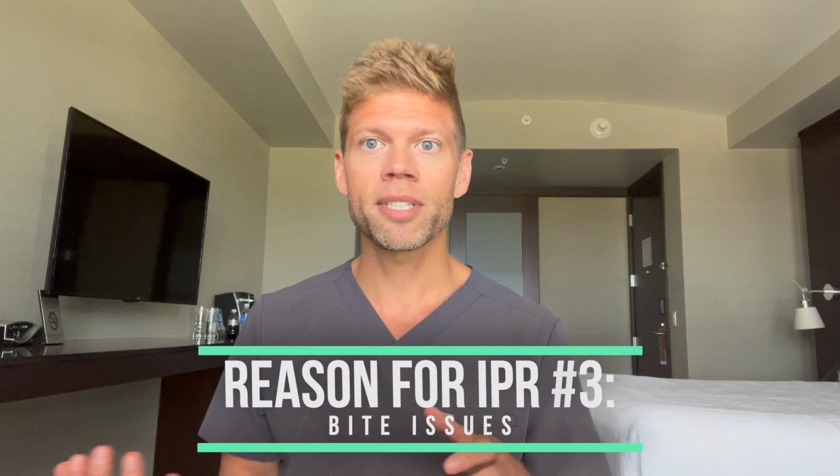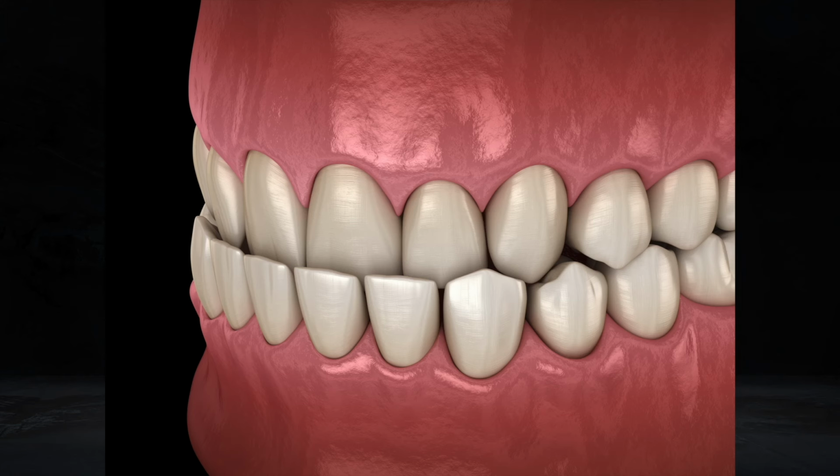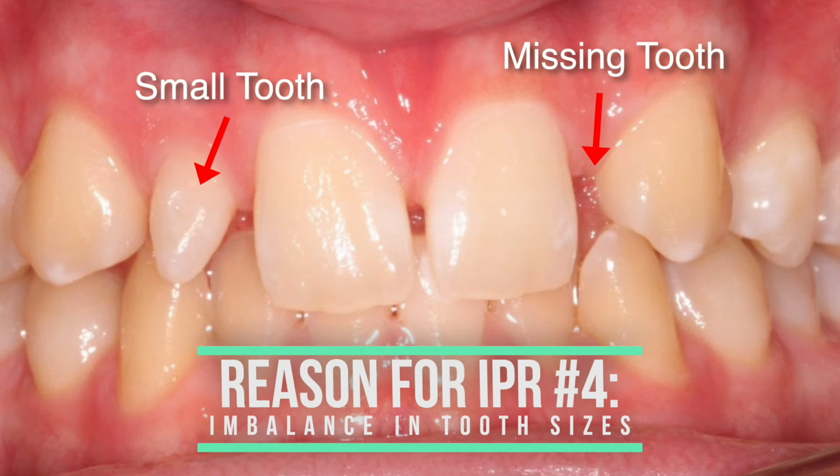A third reason why you might need IPR is because the bite doesn't fit properly. So sometimes in cases where the upper teeth stick out too far from the lower teeth, we'll do some IPR in the upper teeth to bring them back. And then same, if the lower teeth are out too far from the upper teeth, or what's called an underbite, sometimes we'll do IPR in the lower teeth to bring them back behind the upper teeth. One more reason could be there's a tooth-size discrepancy between the upper and the lower teeth, and it doesn't quite fit right. Next tip is cleaning your aligners.